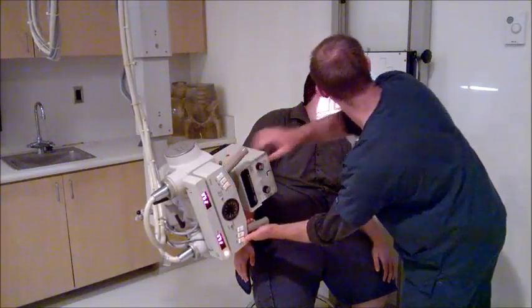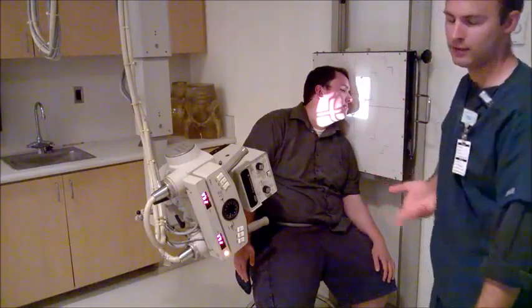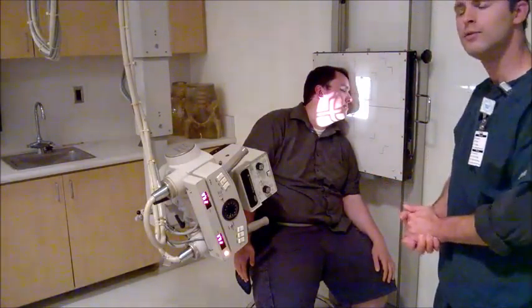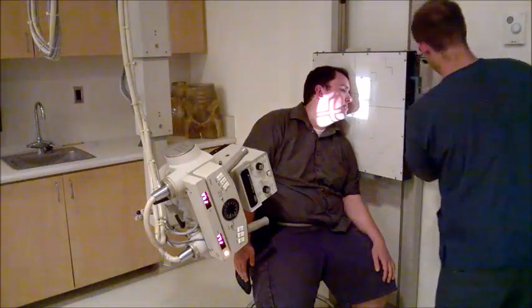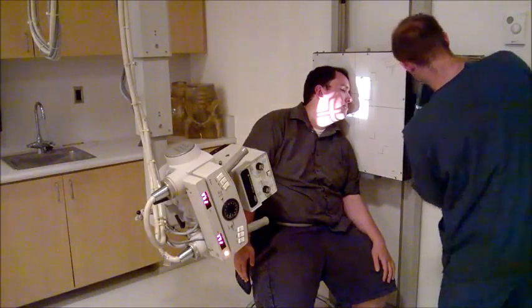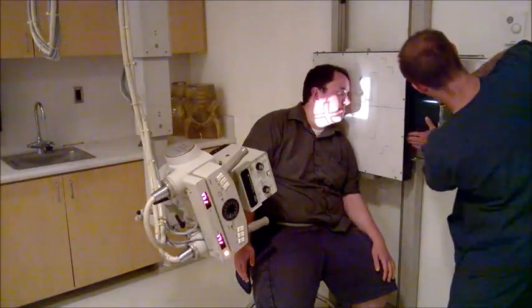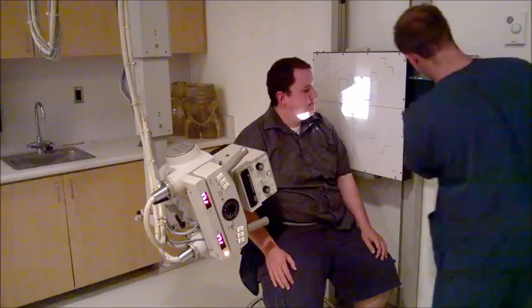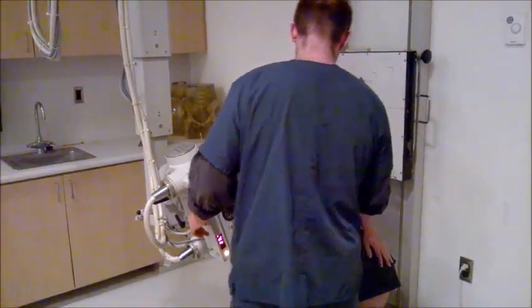Right about there. Left marker goes on, same thing, 70 kVp at 18 to 20 mAs. I'll take this, beep. Scan, read, come back, and now 8 by 10 lengthwise. And now, sir, I'm going to have you stand up.